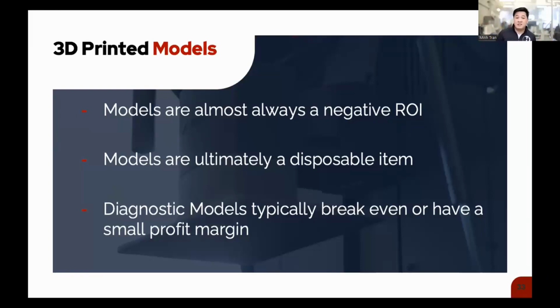Whereas if you're doing these digitally, I have beautiful libraries. I'm able to knock out 2, 3, 4 of these in an hour. We're still charging that $20 per unit, and we charge a material surcharge of printing these models on top, $30 for the set, right? And that's just to cover kind of material overhead. But at that point, you're actually able to generate a little bit of a profit margin on top of this. So with this digital route, I'm whipping up full diagnostics all day long. Everybody's happy. All this stuff looks fantastic.